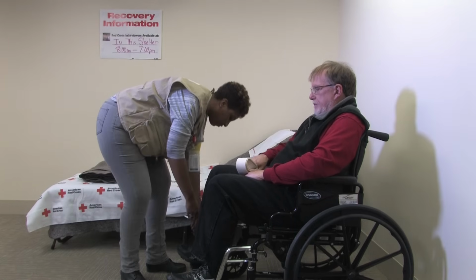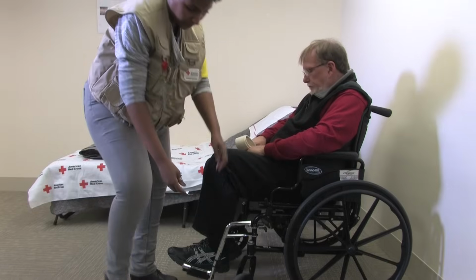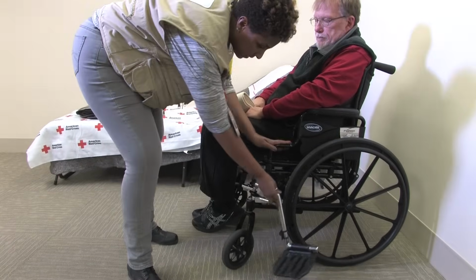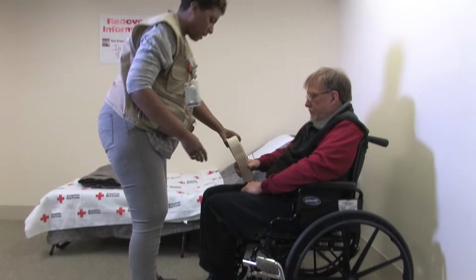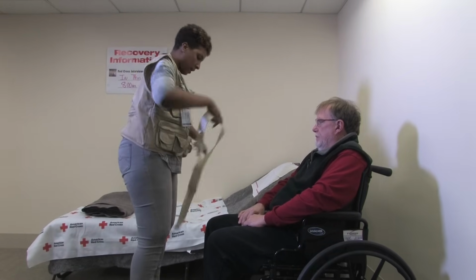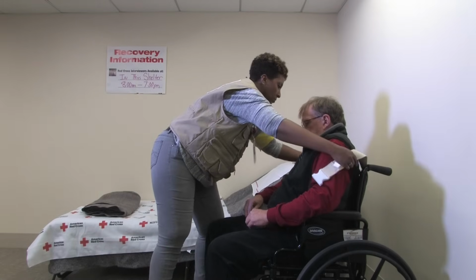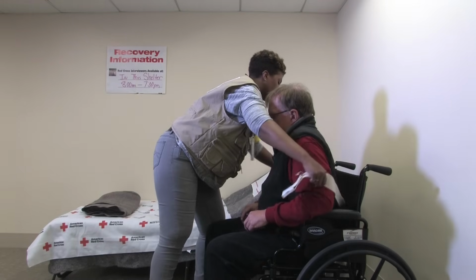And if you could lift your feet up, I'm going to move these out of your way. And I'm going to put your belt back on you so I can assist you in getting back on the cot. And I need you to lean up just a bit. Okay. There you go.